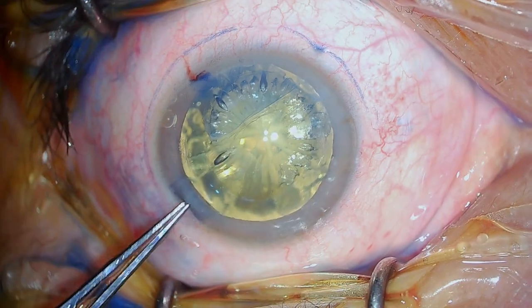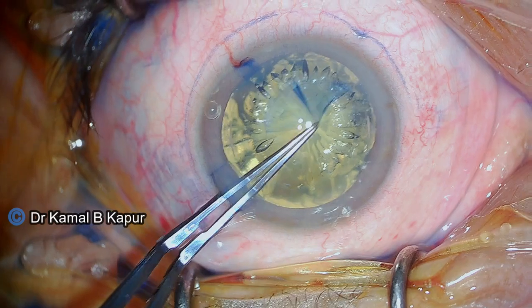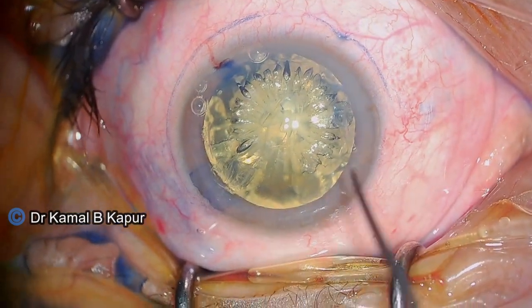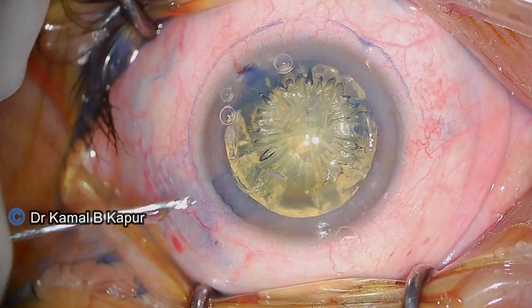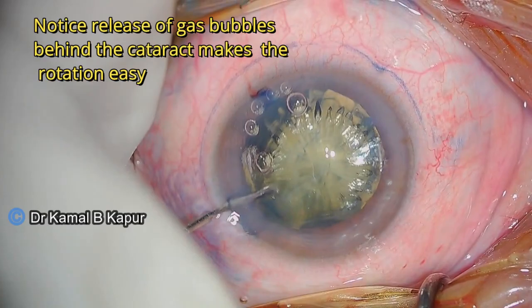These corneal incisions compensate for the lower astigmatic IOL available. You will notice that the free floating capsule rexis has been removed, and now I proceed to open the clear corneal incisions, which will ensure the complete effect of the relaxing incision onto the cornea.